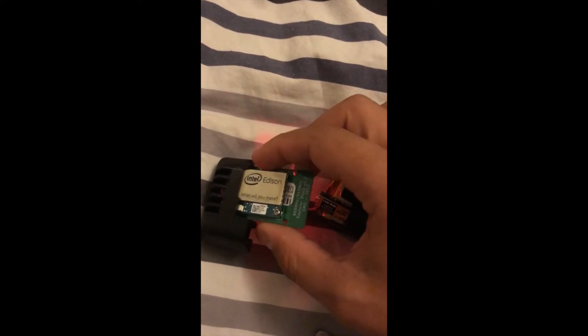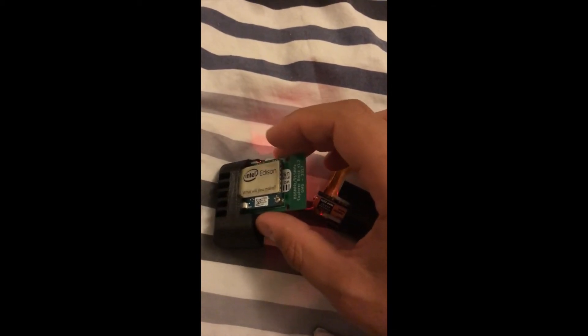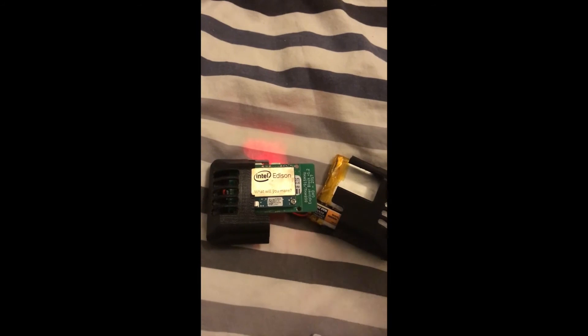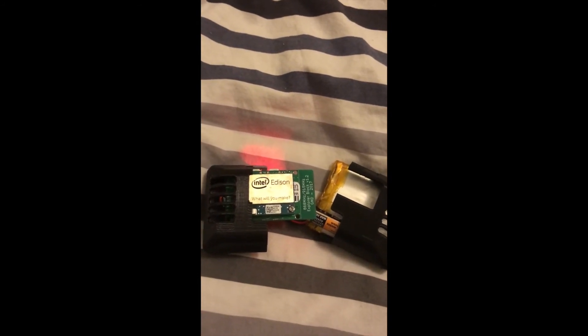Then it transmits a signal to your pump through this explorer block, which transmits at just the right frequency so your pump can understand, and it sets a temporary basal on your pump if your blood sugar is going too high or if your blood sugar is going too low.